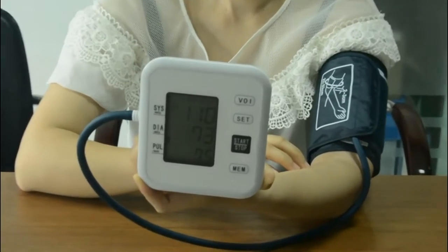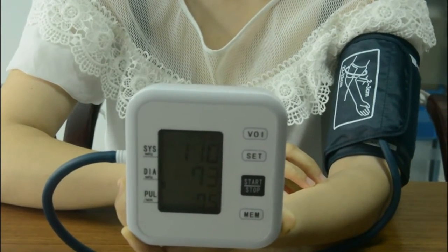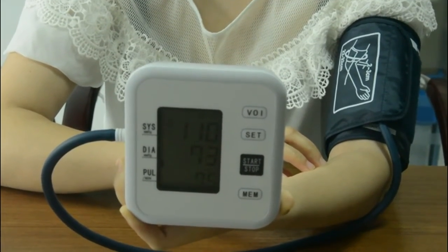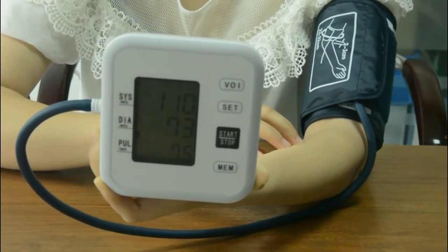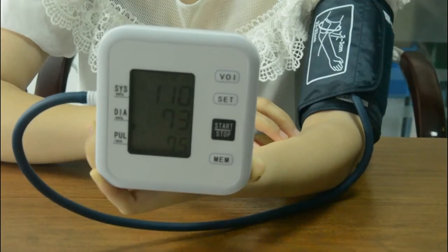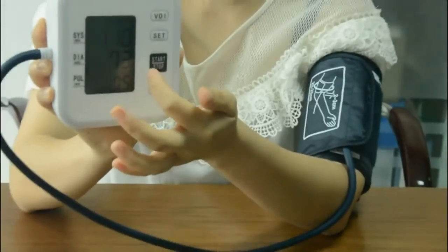Your blood pressure is systolic 110 mmHg, diastolic 73 mmHg, and your pulse is 75. Your blood pressure is normal. This is the test result for me.